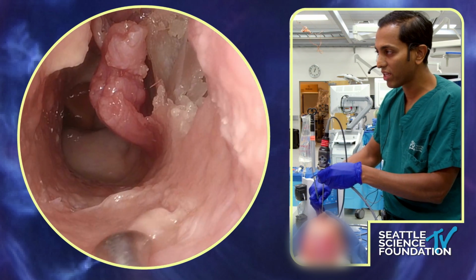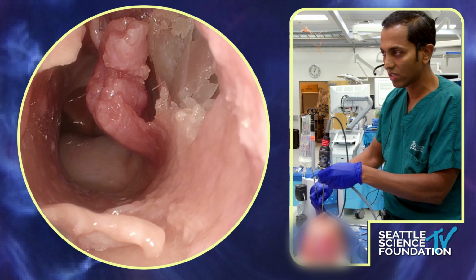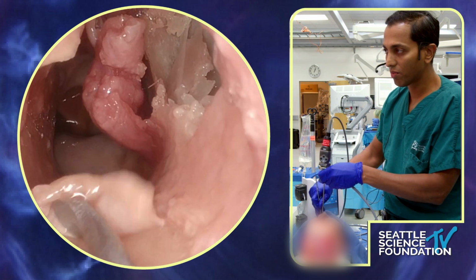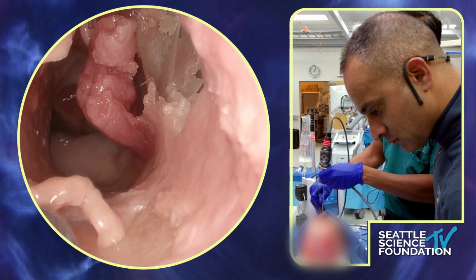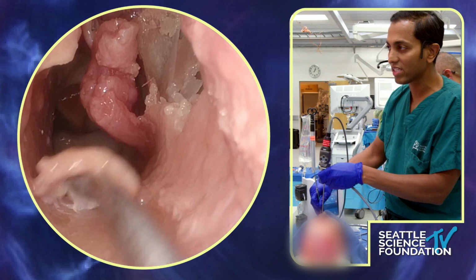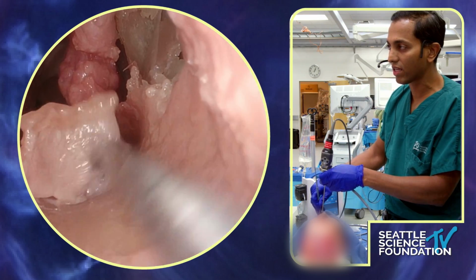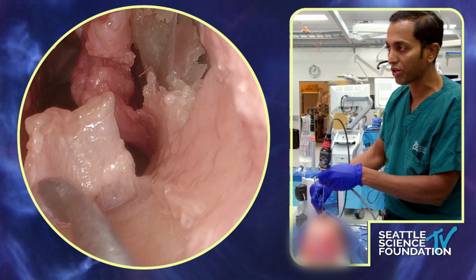So once you've created that, then you can just elevate that nice little graft like this. Let's see if we get it all up. And again, either mark it beforehand so you know which side's the mucosal side, or make sure when you take this thing out that you're keeping the laterality of it so you know where to go with that.